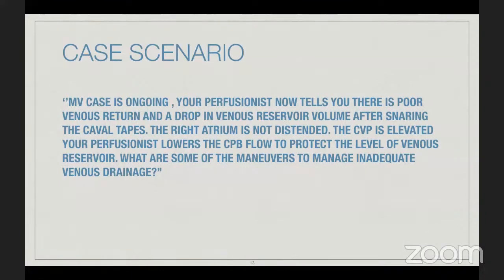Okay. I have to check the venous cannula itself for any kinks. And? And maybe the reservoir, I can lower it a little bit more so the siphonage can be even better. If you're depending on gravity? Yes. Okay. Practically it's very hard to lower the patient level. You can raise the patient. Very good. Usually the perfusionist will put it as low as possible. Yeah, you're right. Continue, please.